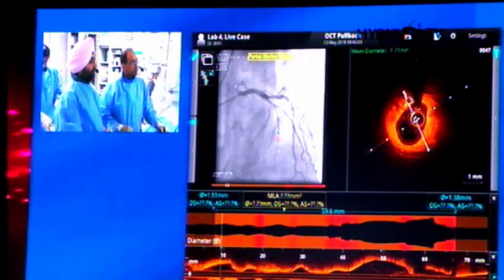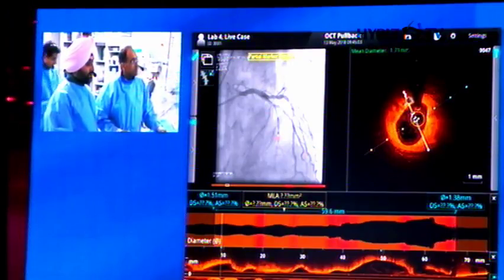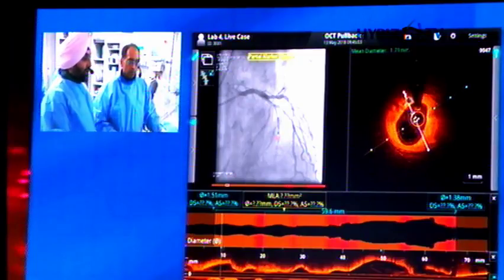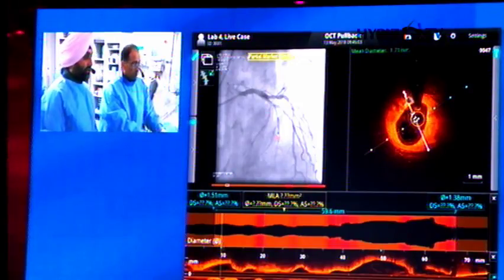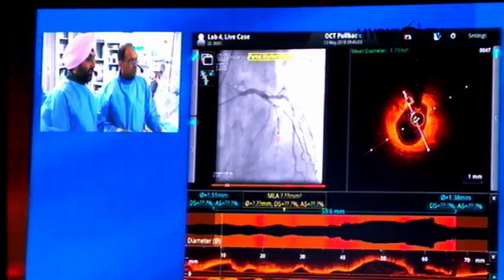One second before you go, just for the audience, this is a really, really important point because they've measured EEL to EEL, unlike the lumen contour, which gives a luminal area. If you size only based upon the luminal area, you will grossly undersize if you use OCT in that way. So this is a great demonstration of how you would do sizing, and you discount it a little bit because you don't want to have a distal flap or issue that way. So great demonstration.